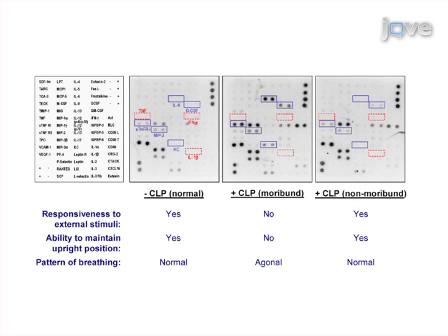Within a few hours of cecal ligation and puncture, or CLP surgery, animals exhibit clinical signs of sepsis that include piloerection, lethargy, huddling, and a decrease in food and water intake. Animals developing severe peritonitis with consecutive systemic infection normally die within 48 to 96 hours. However, even age, sex, and genetic background matched animals can respond to the surgery in a distinguishable manner in the course of experimental sepsis. For example, at 48 hours post-CLP, while some animals may have approached the moribund state as defined here, others may remain at a non-moribund state.